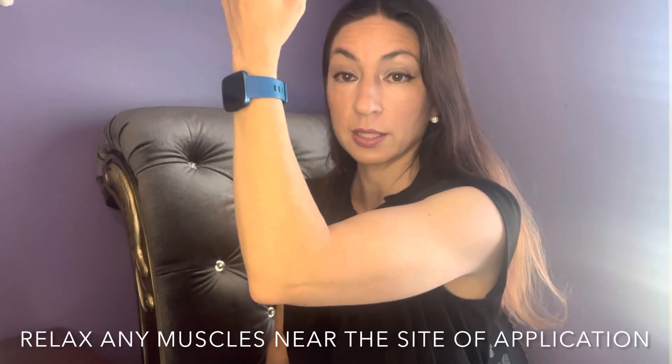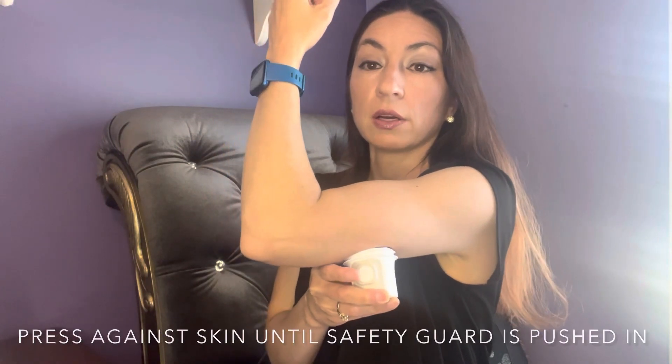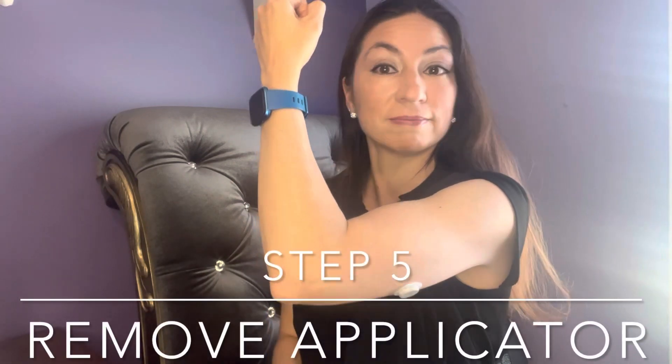Make sure that you're not tensing up your muscles. You're going to put this up against your skin, press the clear safety guard against it, then press the button and remove the applicator. That's it. You're going to want to recap this, but you need to save the applicator because you're going to need the code on the applicator so that you can pair it to your app on your phone.